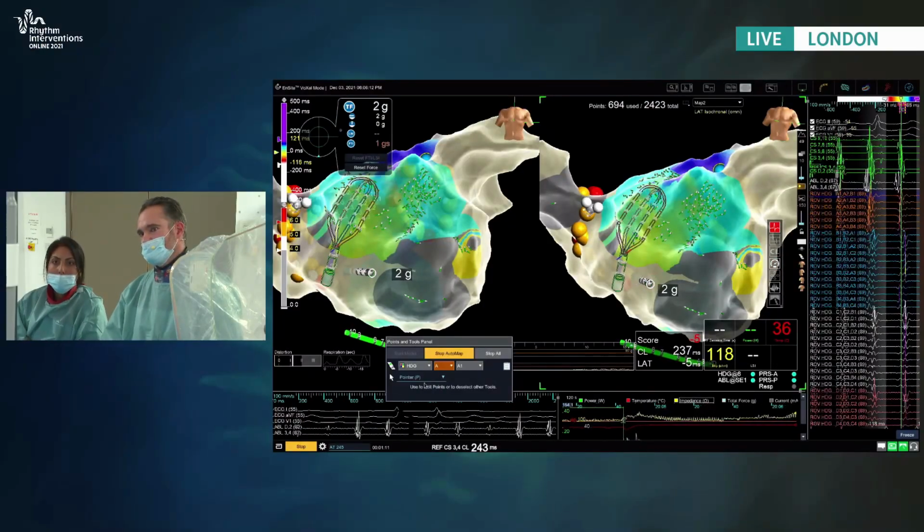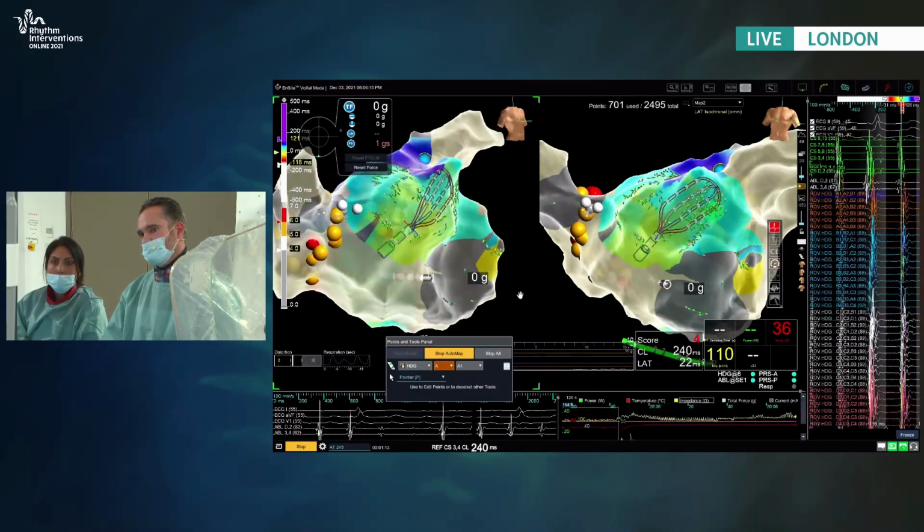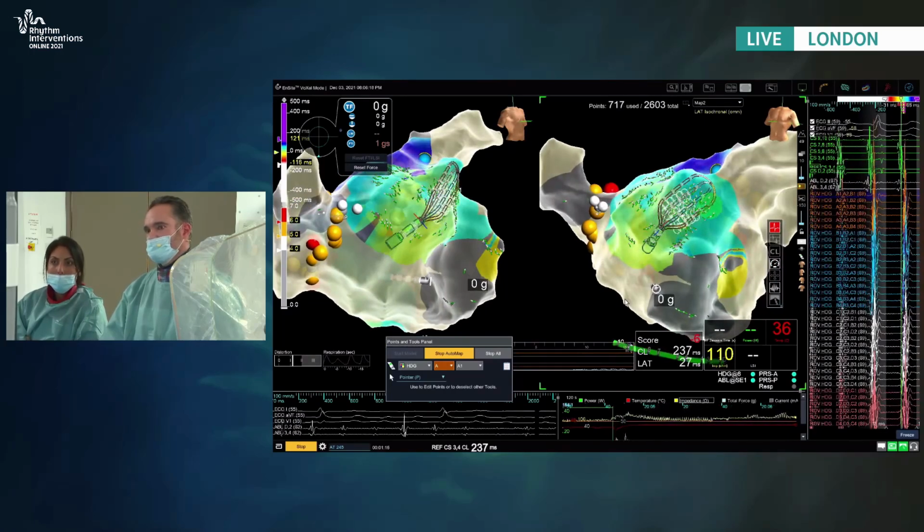I tell the fellows it's like a pair of blue jeans. You've got the legs, and then you've got the seat of the blue jeans, and where's the waist? And if you say we want to incorporate all the antral tissue, much of that, like Andrea Vitale's been telling us, is the whole posterior wall is really antral tissue. So I think when we go in there and ablate the veins and the posterior wall, oftentimes it's all the more osteal part of the vein. So I agree that with the balloon-based technology, you're much more distal, and that's why I always use RF for a second procedure so I can get a much more broad accompaniment of the antrum.